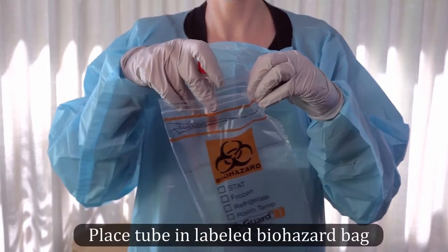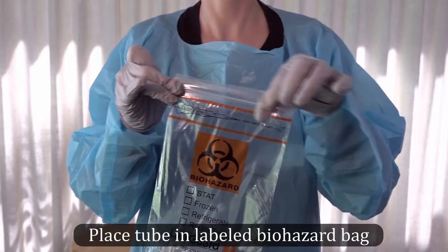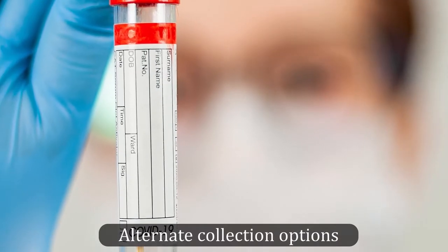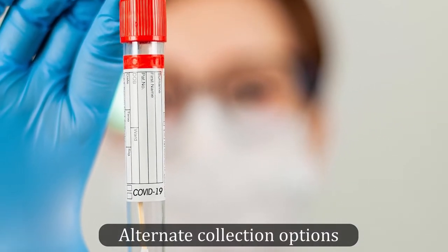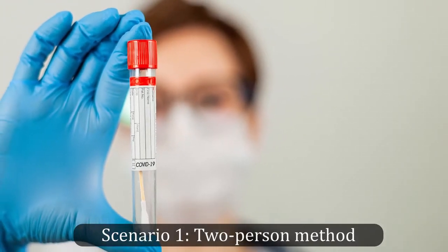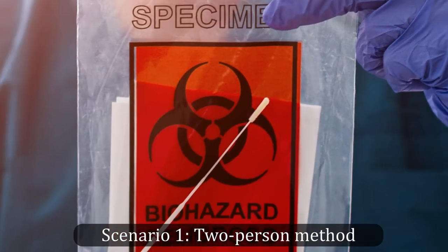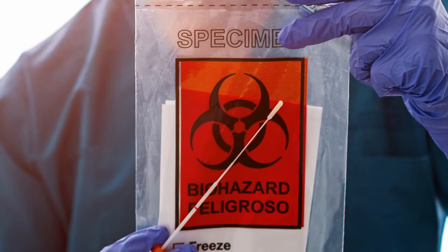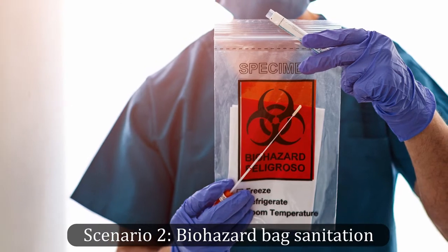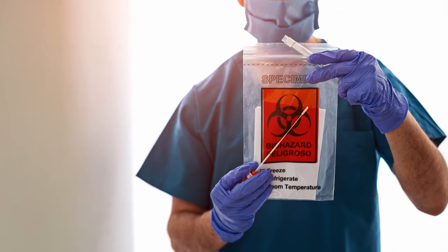Place the collected sample into a labeled biohazard bag and, depending on the protocols at your practice, transfer it to a team member outside of the testing area. When bagging the cultured tube, there are a few options to avoid contaminating the specimen collection bag. One is a two-person method involving someone other than the clinician who collected the specimen holding and sealing the bag and removing it from the examination room — the second person should be wearing a mask and gloves. When the person who collected the specimen also bags it, the exterior of the sealed biohazard bag should be cleaned with a disinfectant wipe prior to handoff.